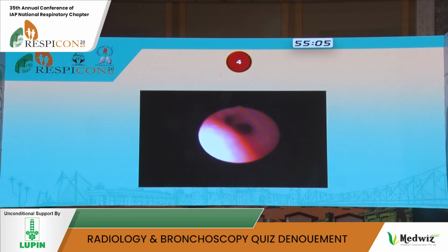But what happened is, when you withdraw the bronchoscope, you do it very, very slowly. So millimeter by millimeter, you withdraw. So when you did that, you find there is an H-type fistula. So why was the H-type fistula missed in the first place? That was not because the person who was doing it was inexperienced. It was because it was being done by a surgeon who did a rigid bronchoscopy. So the fistula was so high up, it was just below the vocal cords. So when you do the rigid, you often surpass that part with the rigid scope, and that is why there is a very high chance of missing it.